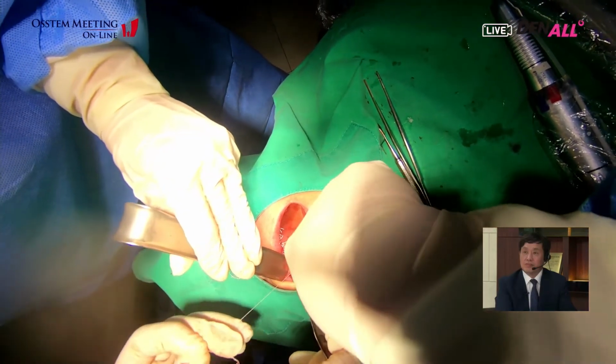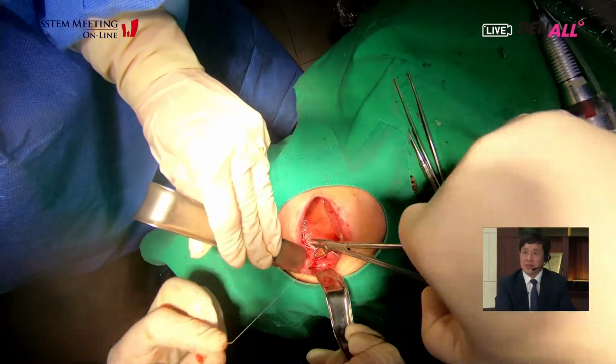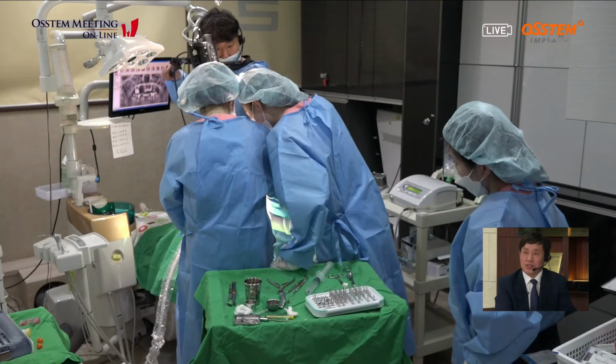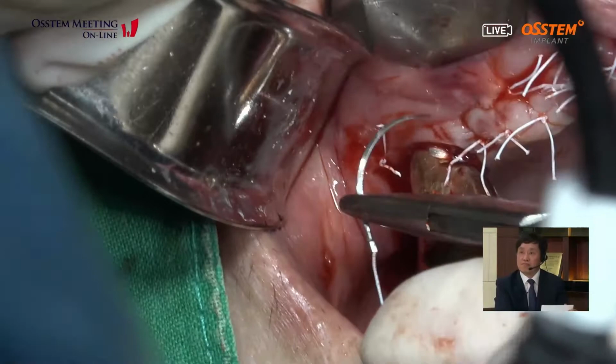This is the final suture. Okay. He did the final suture of the right vertical incision. So, one more suture here. The papilla.